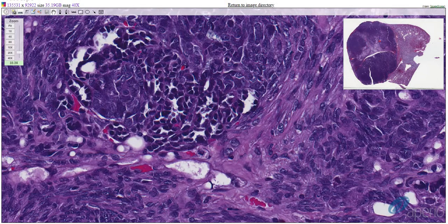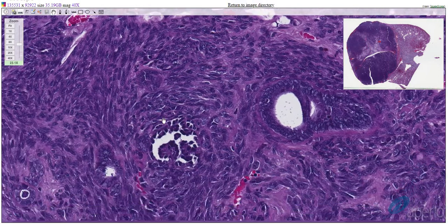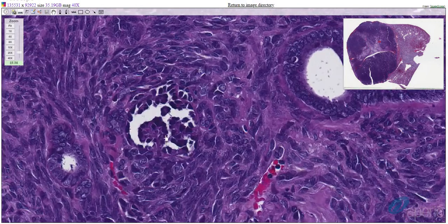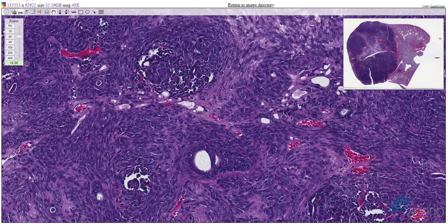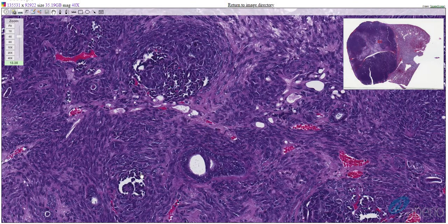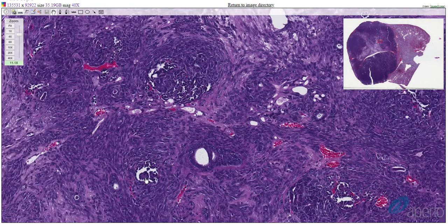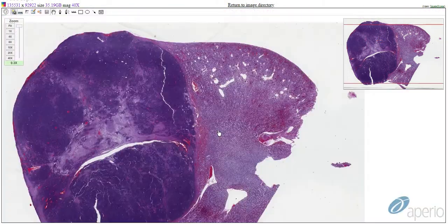Blastemal cells form nests and cords. They have a scant amount of cytoplasm and indistinct cell borders with a high nuclear-to-cytoplasmic ratio. Nuclei contain clumped chromatin. Occasionally, we'll see some tubules have papillary projections that resemble primitive glomeruli. The disorganized mixture of these three components along with the primitive glomeruli are distinct features of nephroblastoma.